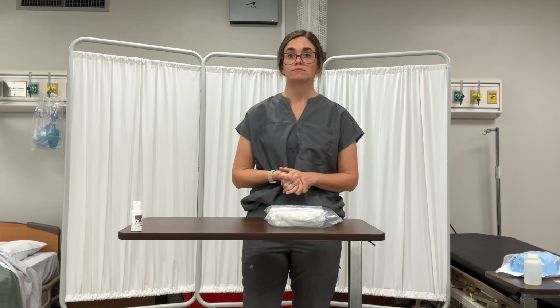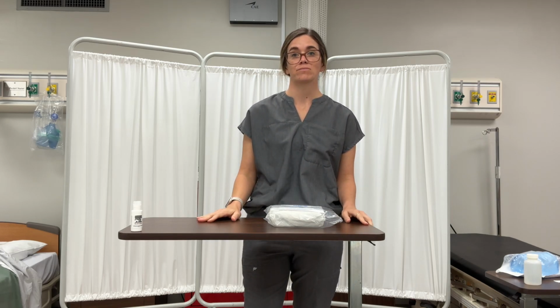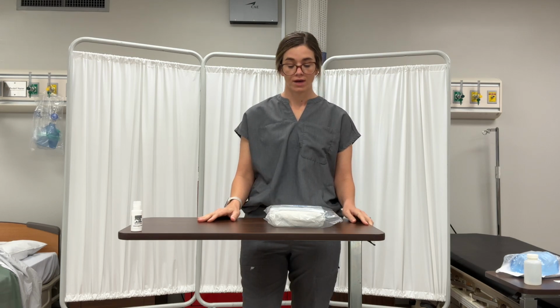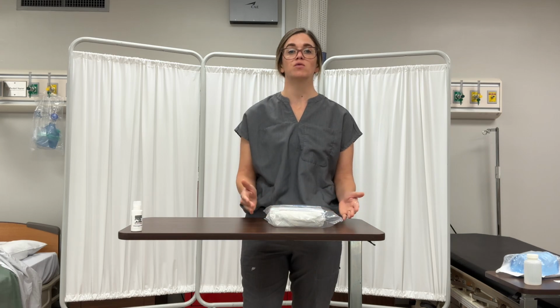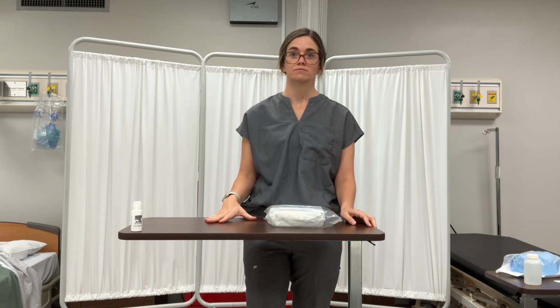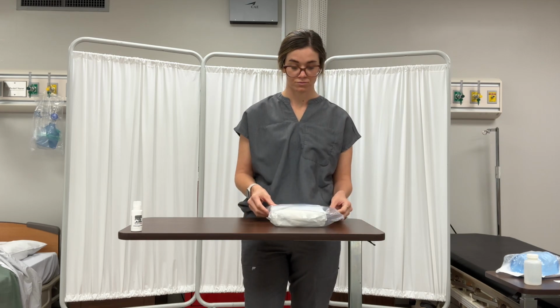The second thing is we're going to make sure a sterile barrier that has been permeated by punctures, tears, or moisture must be considered contaminated. So if you get anything wet or anything rips, your field is no longer sterile. Once a sterile package is opened, a 1-inch border around the edges is considered unsterile.